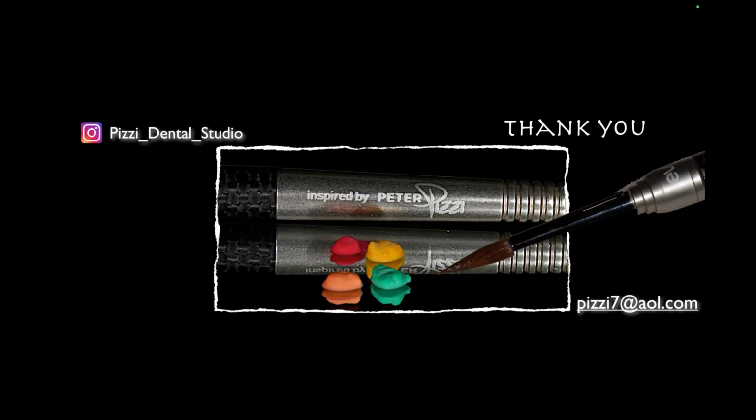So can I make a PFM look good? I think so. I think I'd still say that out of all the materials we have today, I could still probably do the most with PFM because of the thinness of the coping, right? I have the ability to make it 0.2 of a millimeter, and then I could do layering all the way through and surrounding margins and blah, blah, blah.